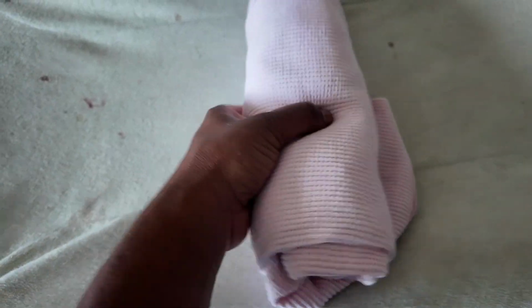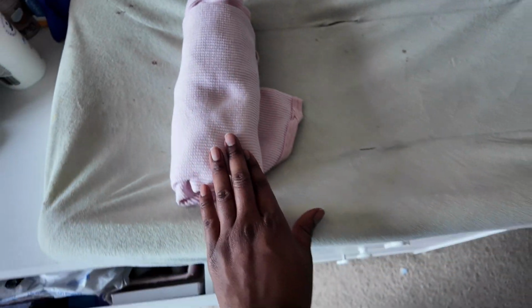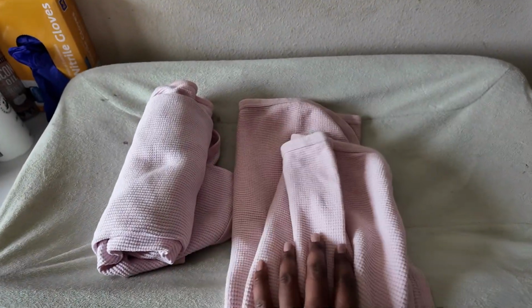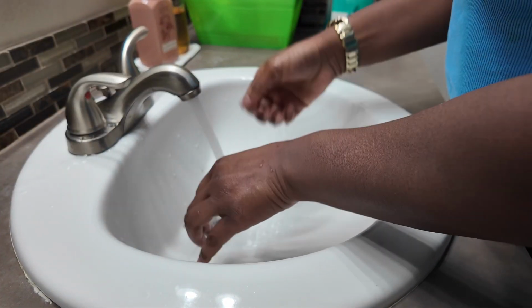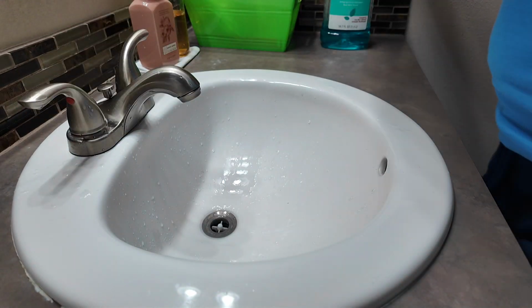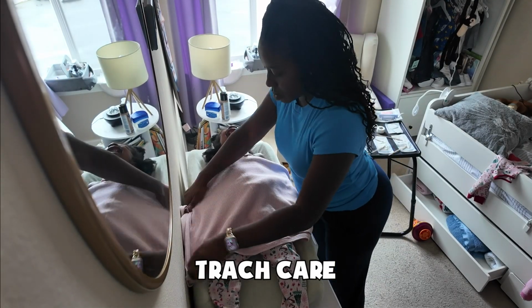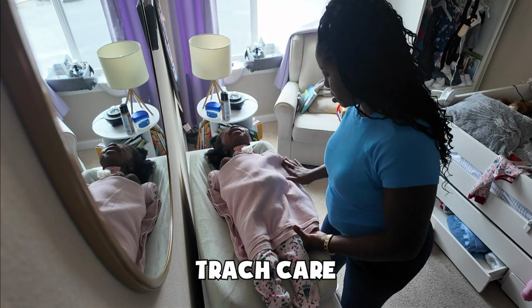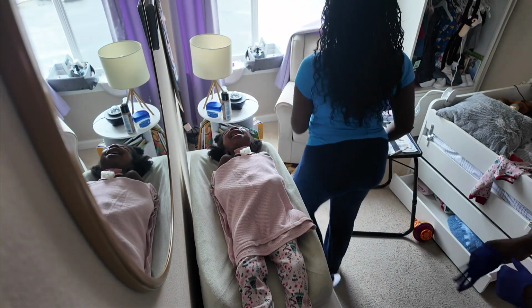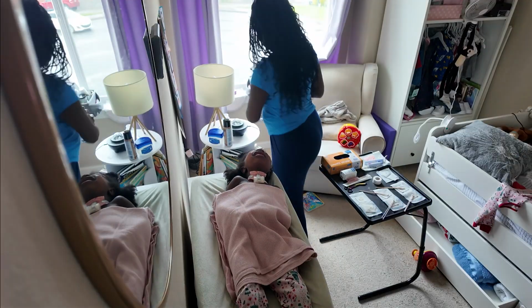We use this roll, just a pink towel roll, to place under her shoulders so the neck area is open and you have a bit of an arch. And then we're going to have this to wrap around her body. Some people are squirmy, some people are not. Again, I'm going to wash my hands again, dry them, use some hand sanitizer before I glove up. So I'm swaddling her. She is pretty good during trach care, but sometimes her hands move around and you just want to make sure it's really protective.